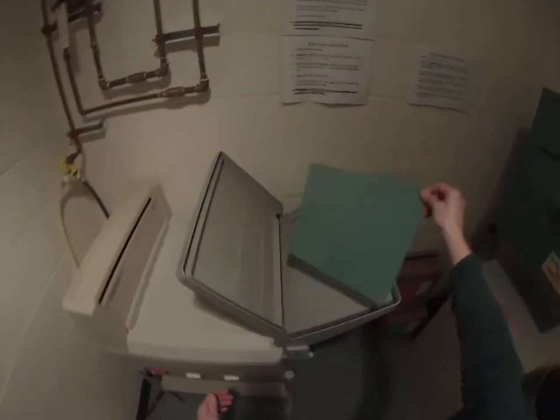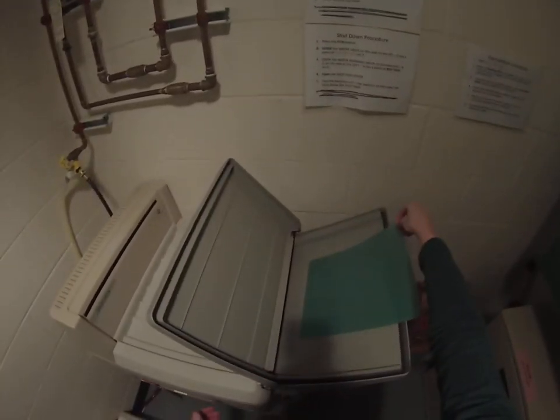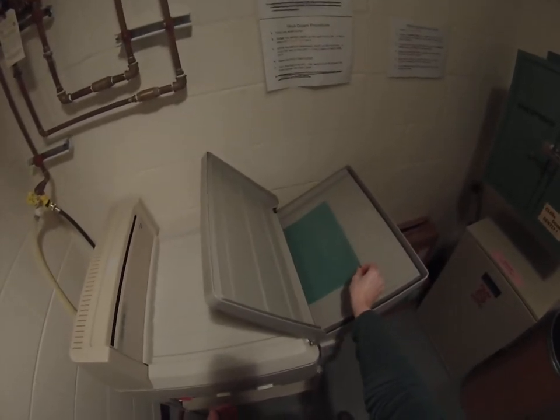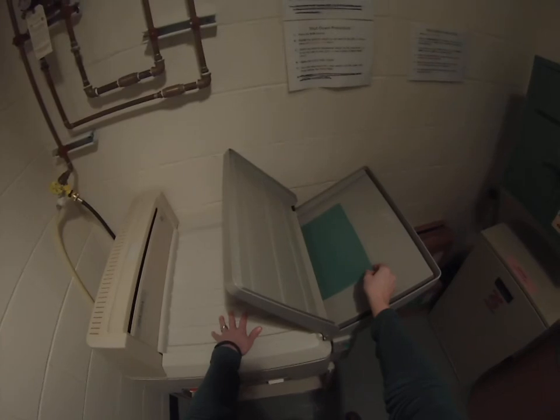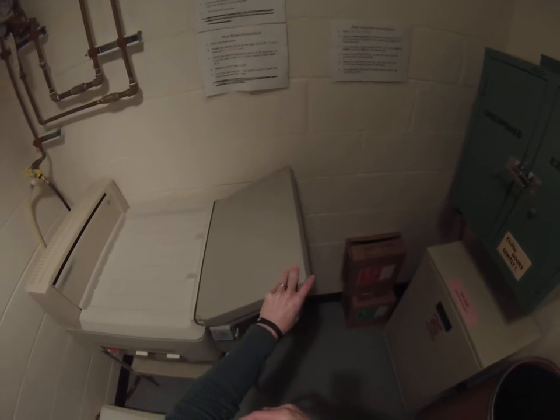We can open the feed tray cover. Place the film in — it can go horizontally or longitudinally, it does not matter. And you will feel the rollers inside the processor grab the film and start to pull it through. Once we're done feeding our film in, we can close the cover.